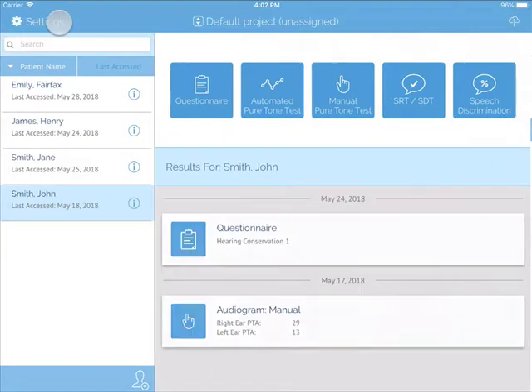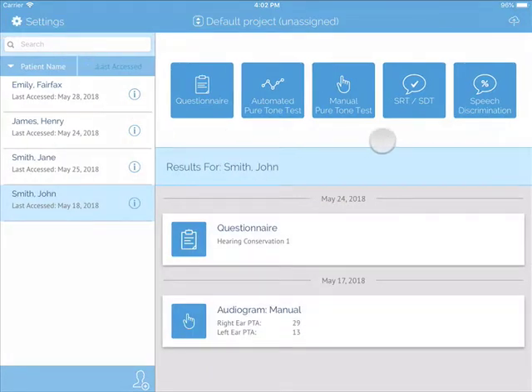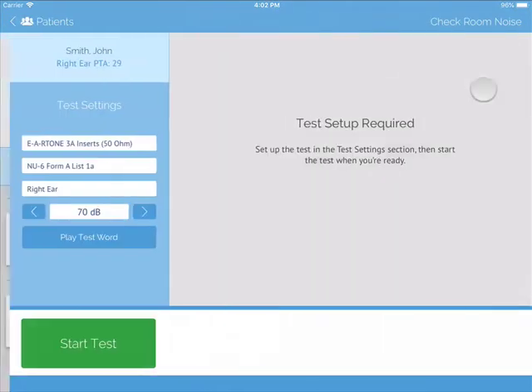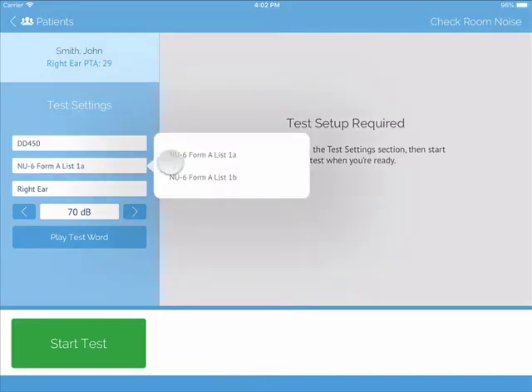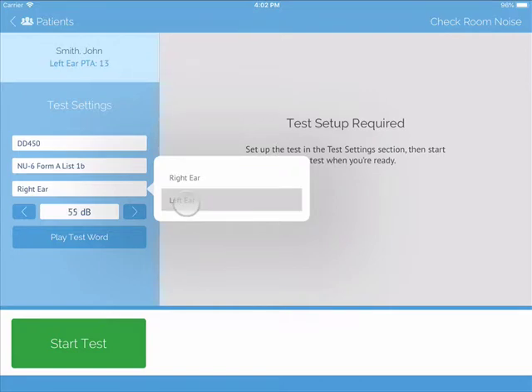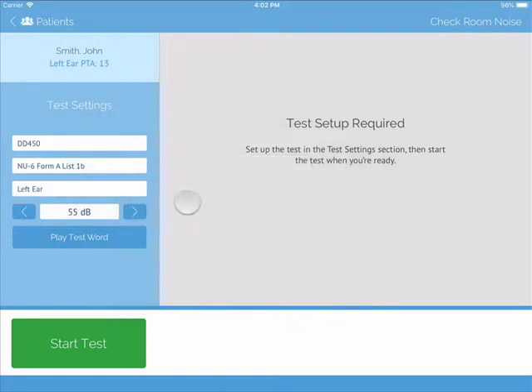To start a speech discrimination test, press the Speech Discrimination button. On the left, choose the transducer you would like to use, choose the word list you would like to use, and choose whether to start on the right or the left ear of the patient. Then, present a test word to the patient to confirm the appropriate dB level for the patient.